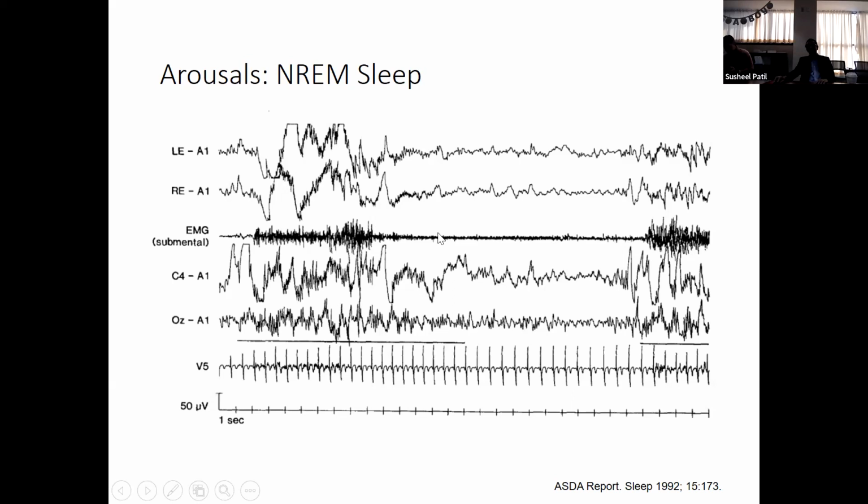And then you can see there's a period of quiescence and a slowing of the EEG for about another 10 seconds before you see another arousal occurring. There are some more subtle things going on within this. The main thing really is the EKG tracing here. You'll start to see that the EKG is faster during the arousal compared to the period during sleep, for instance. So these other clues can sometimes help anchor you in convincing yourself whether an arousal is there or not.